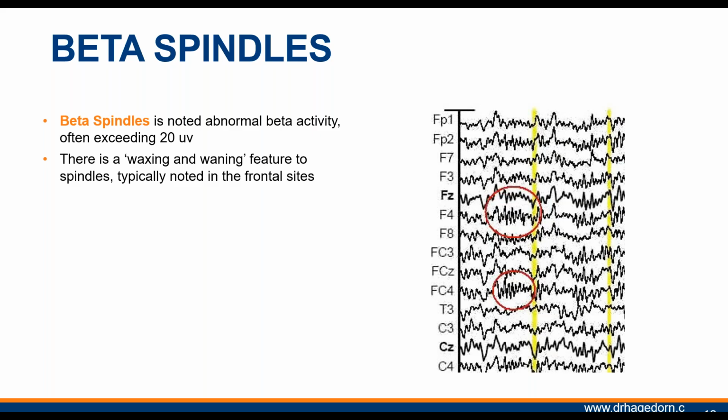So it's not going to be tightly packed for the entire 10-second duration of EEG signal, which is what we give you on the comprehensive report: that 10-second segment of raw EEG.